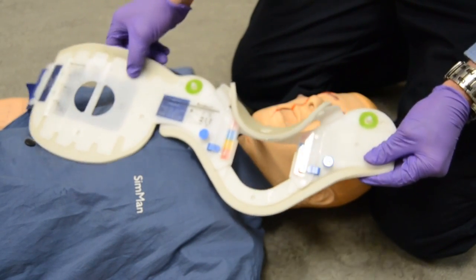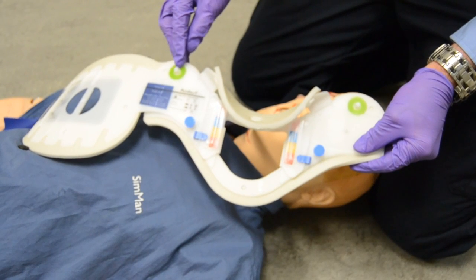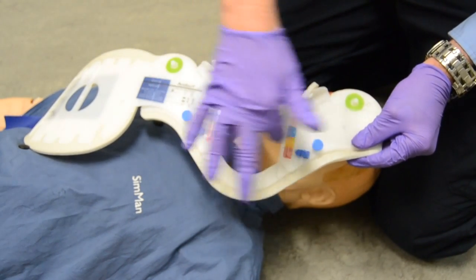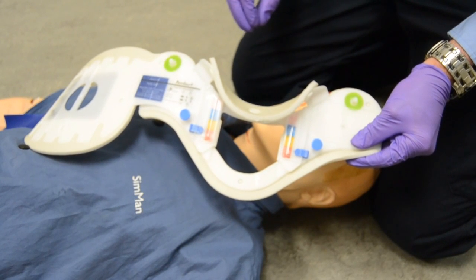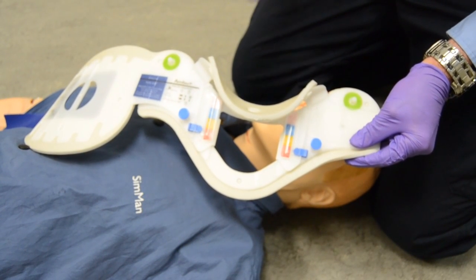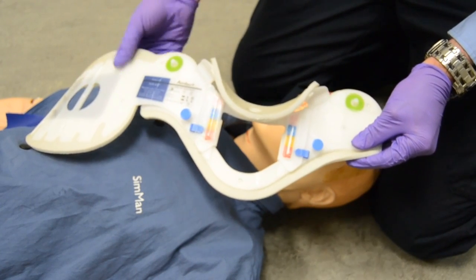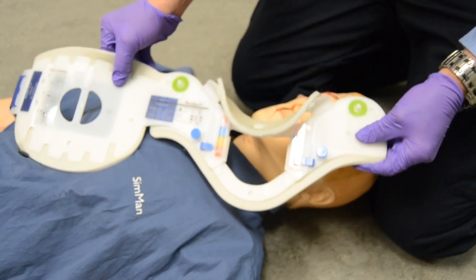You're going to know because I'm getting ready to tell you. These tabs are to take your nasal cannula and place around and secure around the chin, around the patient's head — or a non-rebreather mask with a strap around this so you're able to tighten them up. We'll show you a video later on as to how to do that.